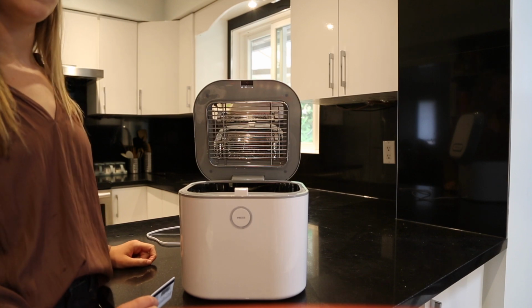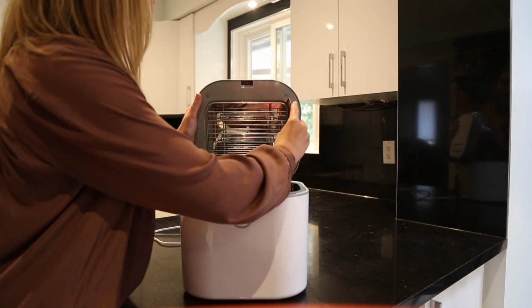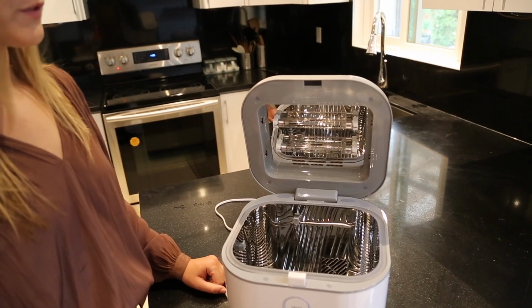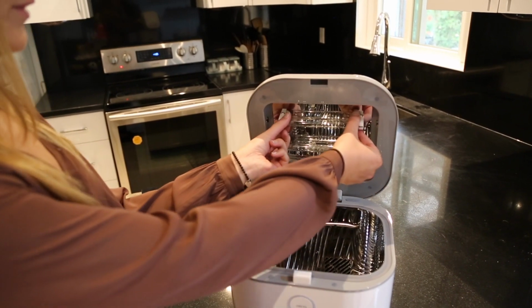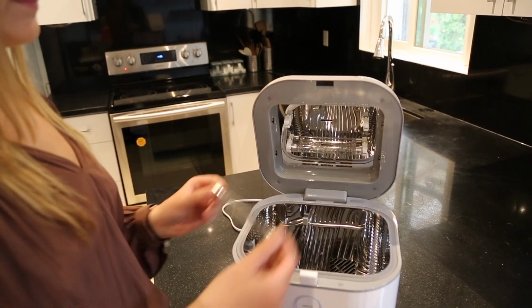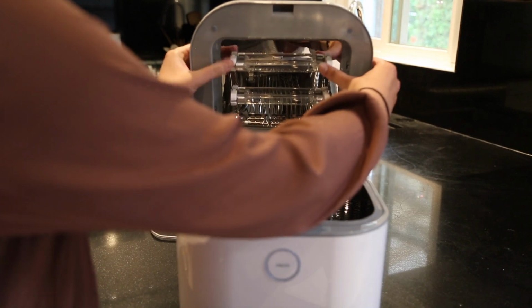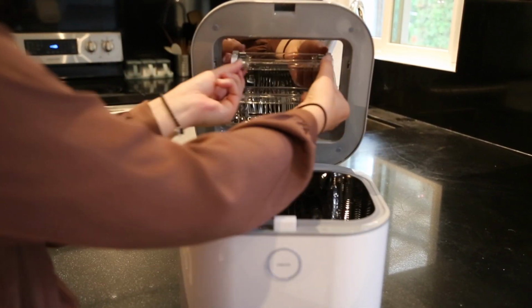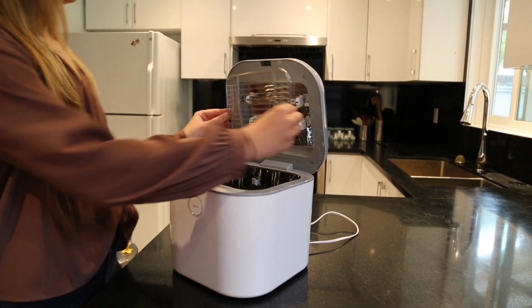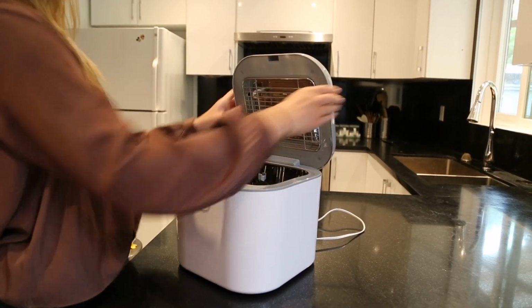In order to change the UV lights, first you're going to remove the cover. Using the card provided, swipe it like a credit card. In order to remove the light, place your fingers on the metal parts, turn it 1/4 of a turn clockwise, and pull it out. In order to install your new light, place it in, push it, and rotate it 1/4 of a turn counterclockwise. The last step is to put the cover back on, making sure that all 4 corners are snapped in place.